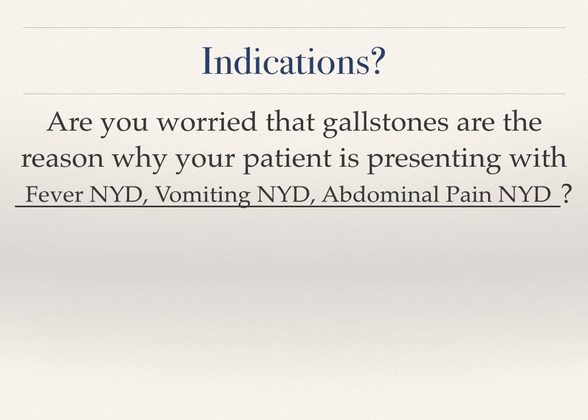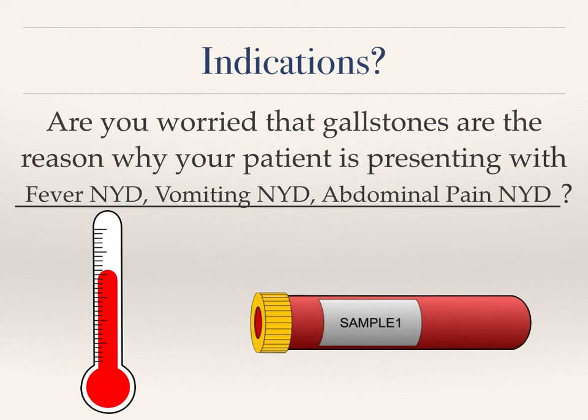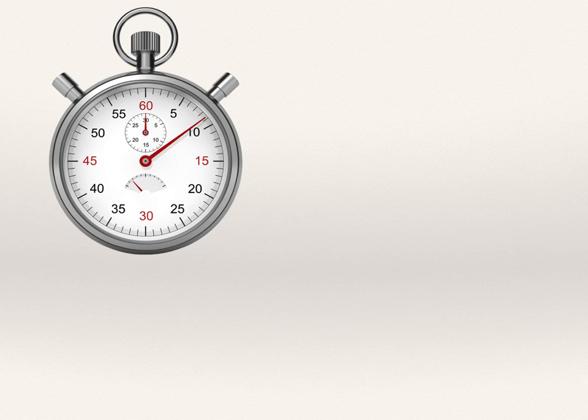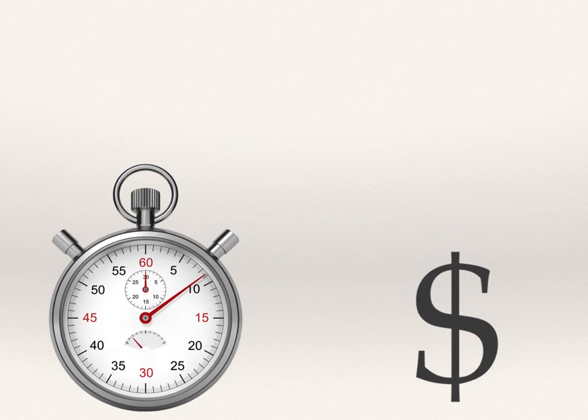Now, why don't we just use the lab work and the physical exam? Fever and tachycardia are often absent, and it's not uncommon for the white blood cell count and LFTs to be normal even. Studies looking at trained emergency physicians have shown that, from a time and a financial point of view, point-of-care ultrasound looking for gallstones and acute cholecystitis can reduce the length of time that a patient spends in the department until they get a formal diagnosis that can be acted upon, and it also reduces the cost to the system.